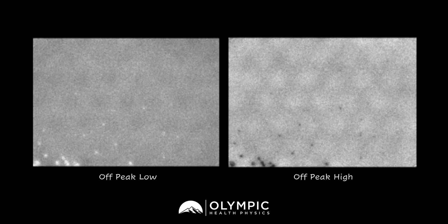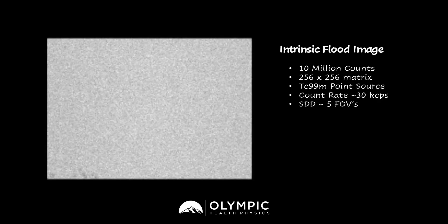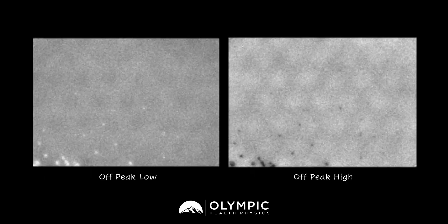Off-peak images also allow us to look at crystal hydration on the crystal itself. Here are the off-peak images — we have off-peak low and off-peak high. If you've guessed crystal hydration, then you would be accurate. This camera was displaying some crystal hydration that we saw with the nondescript non-uniformities, and further analysis with those off-peak images was able to confirm crystal hydration.